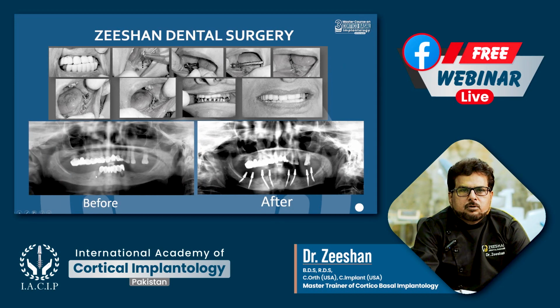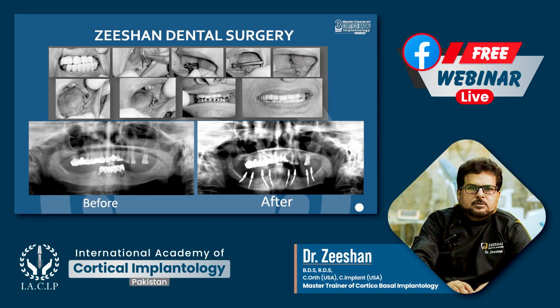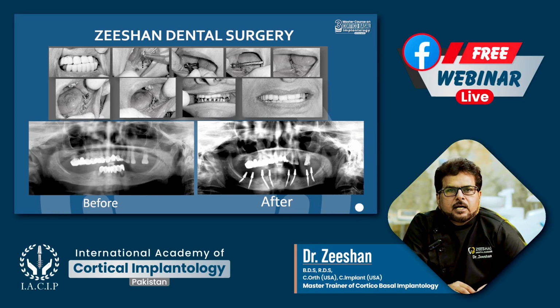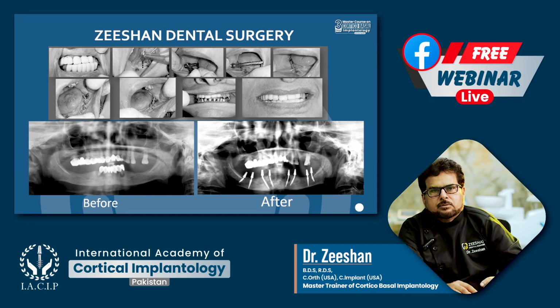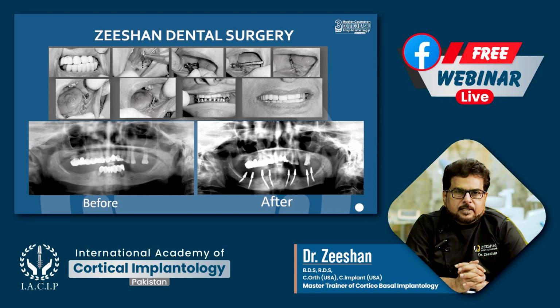Now see the lower jaw. This is another interesting case. Here we have to extract all these mobile teeth, then see at the posterior mandible. We don't have enough space there. The inferior alveolar nerve is not allowing us to go and place the implant conventionally.